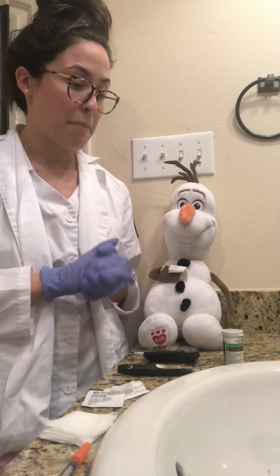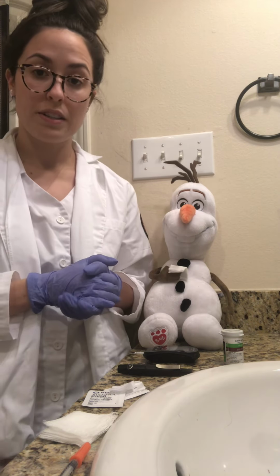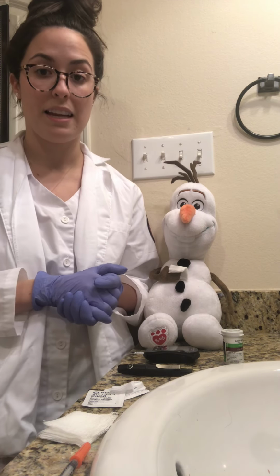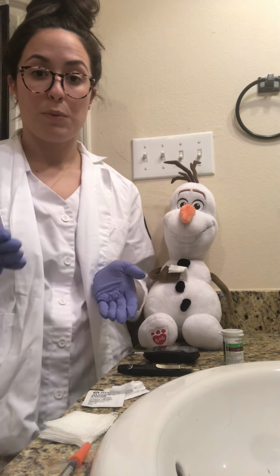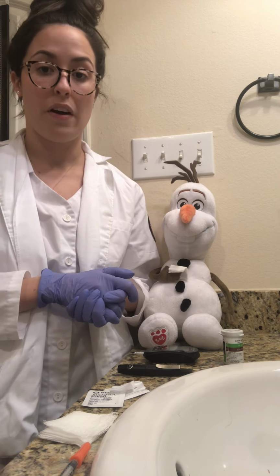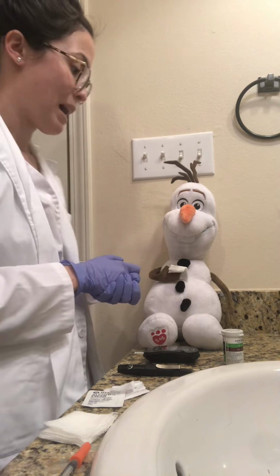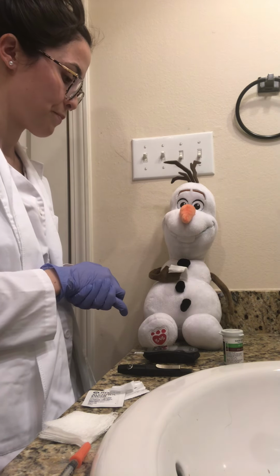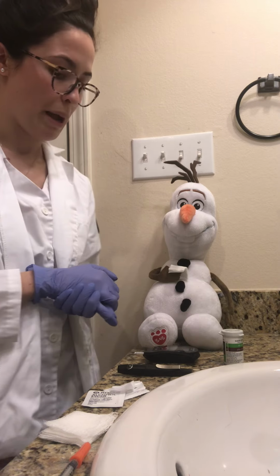And so based on the physician's orders, we will draw up the correct amount of insulin. Now, I'm going to leave the room in order to check the MAR and the physician's orders and verify with another nurse. I will be right back, Mr. Olaf. I'm just going to prepare your insulin real fast. Do you have any questions or anything? Okay, great. I'll be right back, okay?